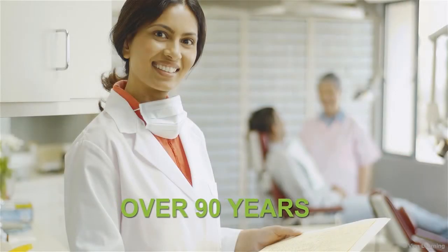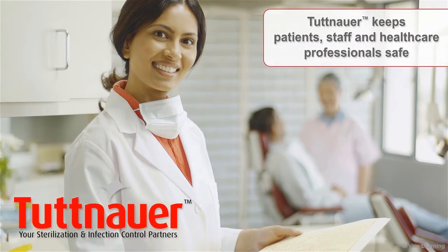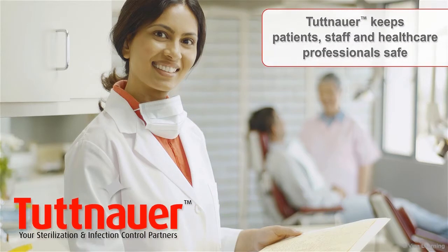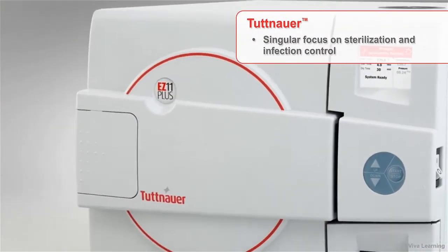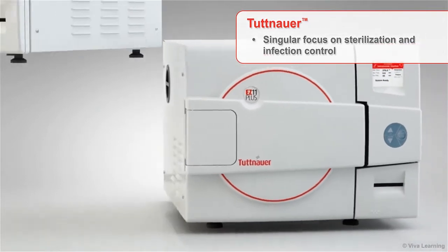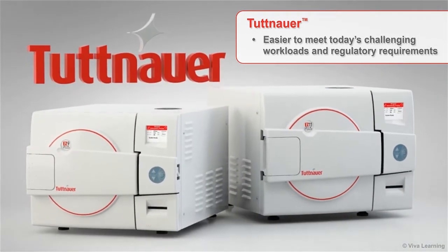For over 90 years, healthcare professionals around the world have relied on Tuttenauer to help them keep their patients, staff, and themselves safe. They know that Tuttenauer's singular focus on sterilization and infection control results in products that make it easier for healthcare professionals to meet today's challenging workloads and regulatory requirements.